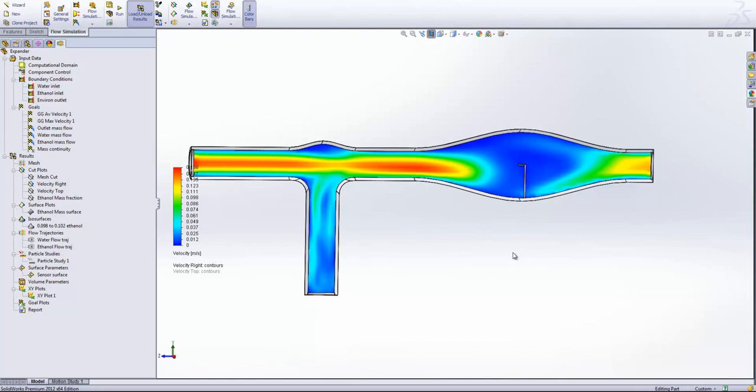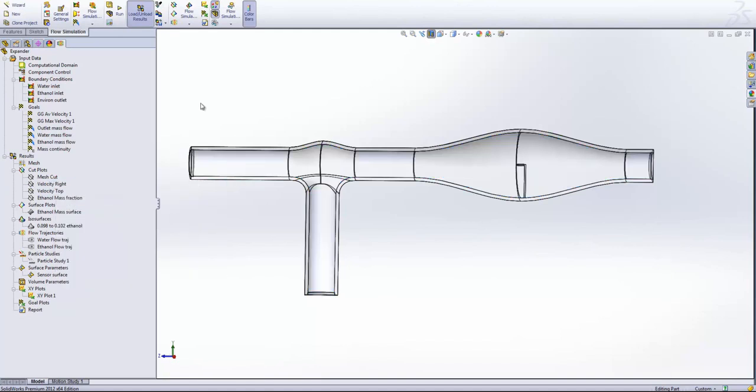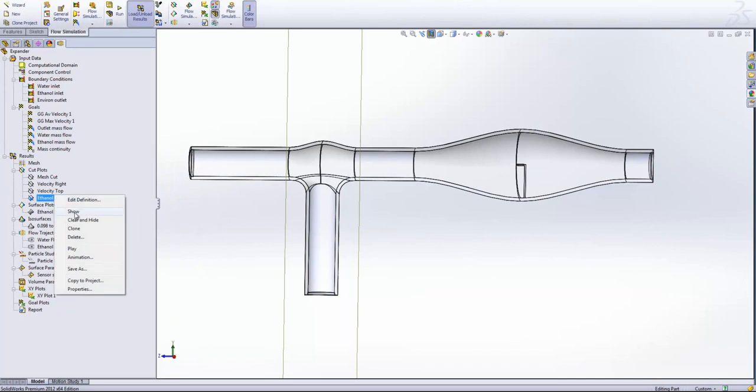That should hopefully have a double effect. One, we are looking for it to generate more mixing, and two, that reduced velocity in this region should reduce the pressure force acting on that sensor, and hopefully generate less stress in the stand that's used in there.